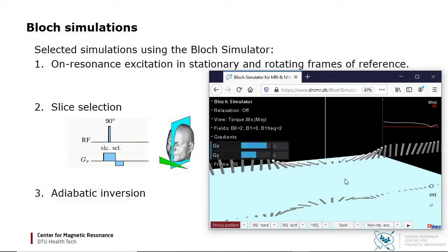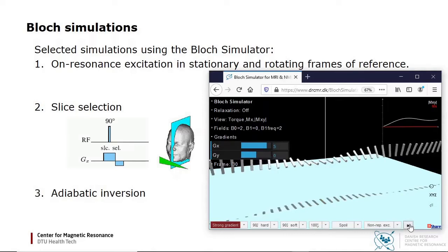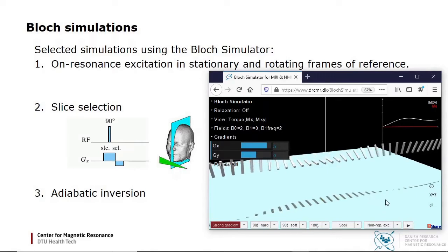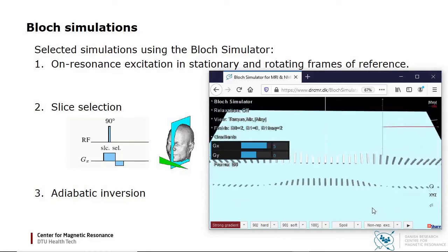I invert the gradient and resume simulation until the nuclei are in phase. You now see the resulting slice profile on the floor. I zoom out to show that it is sinc-like, even though 90 degrees is not a small tip angle.